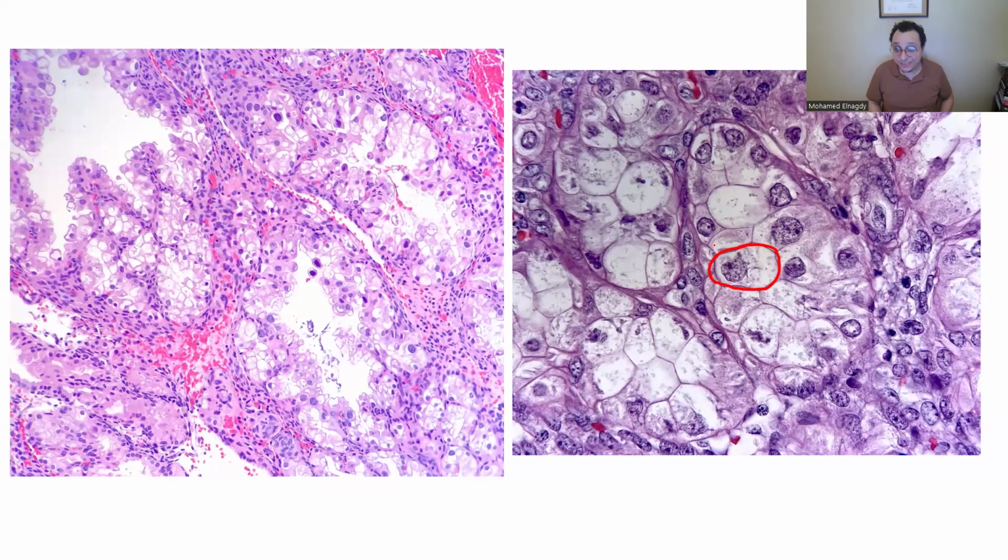Benign endometrium is very tough. I know, I understand, but keep trying until you get there. So if I tell you that this is a female in her reproductive age, maybe Arias-Stella reaction. See, on high power, these are clear cells. These are clear cells, and that's why I show you high power here.